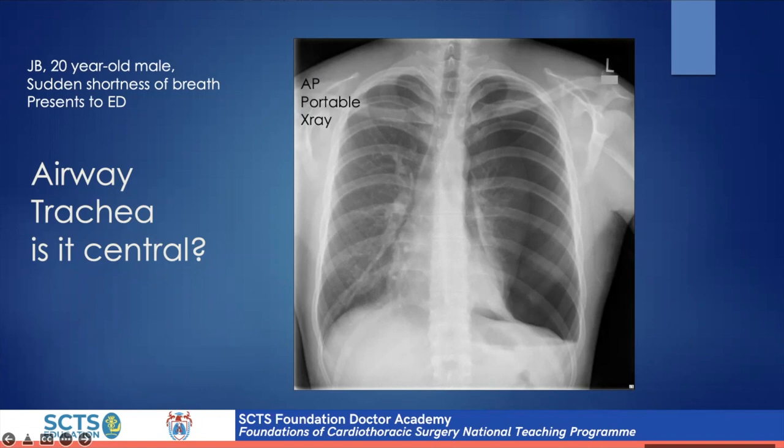So you've gone straight to the trachea moving, deviating away, mediastinal shift, and there's a large pneumothorax there on the left-hand side. Can you also see here, guys, that there's also evidence of a very flattened hemidiaphragm on the left, the tracheal shifting. And can anyone tell me why, in a tension, what is the difference between a tension pneumothorax and a normal pneumothorax?